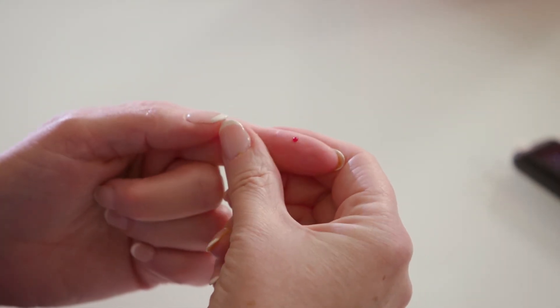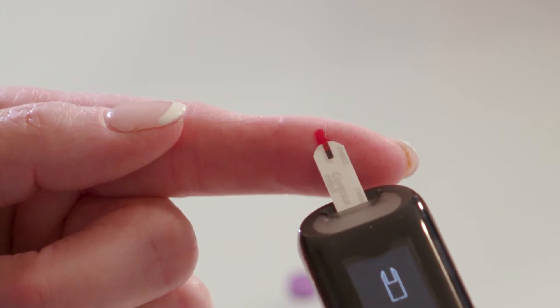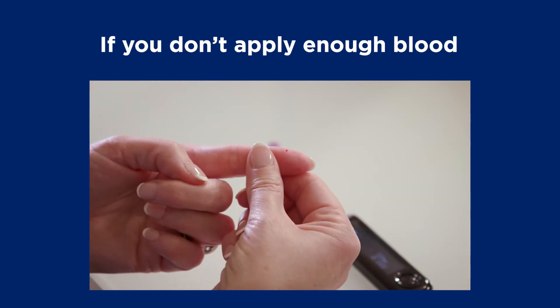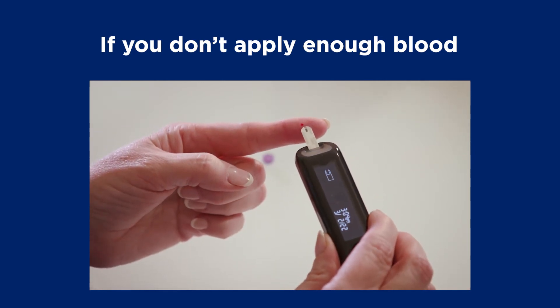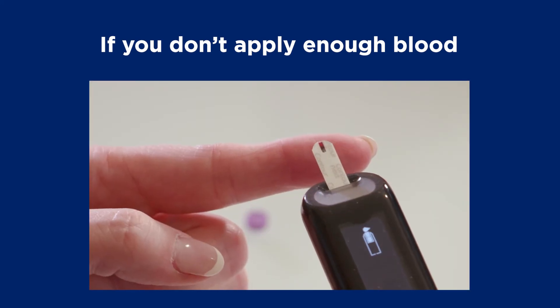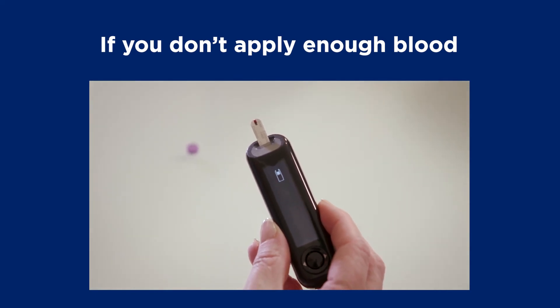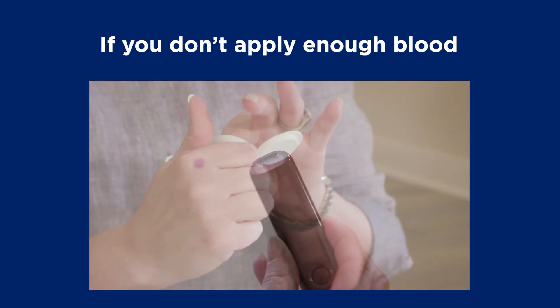When you get a big enough blood drop, touch the very end of the test strip to the drop. The blood will be drawn into the test strip. It won't work if the blood is placed anywhere else on the strip. If you don't apply enough blood to the test strip on the first try, the meter will beep twice and a blood drop will flash on the display. You can apply more blood to the test strip within 60 seconds. If you don't apply enough blood within 60 seconds, the meter will show an error code. If this happens, pull out the test strip and start again with a new one.